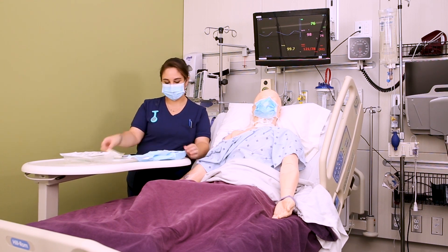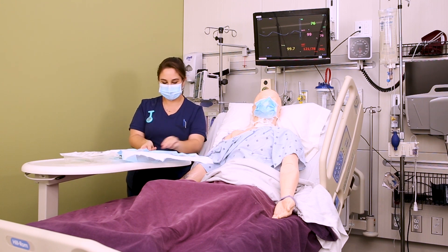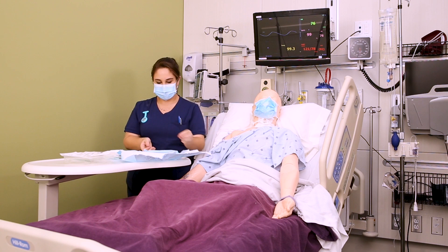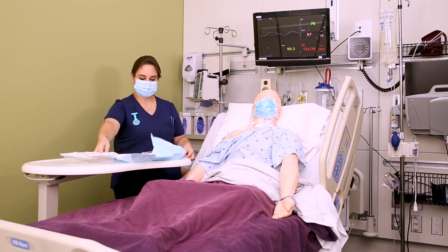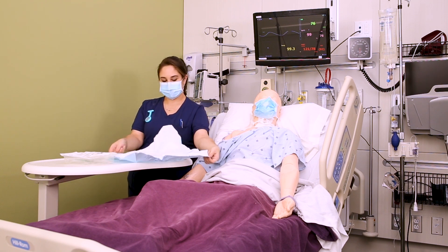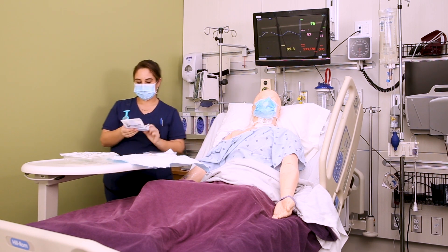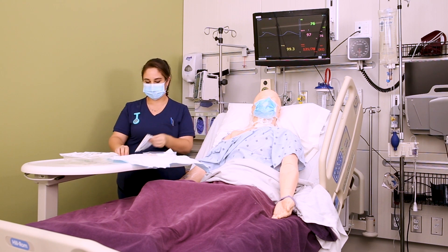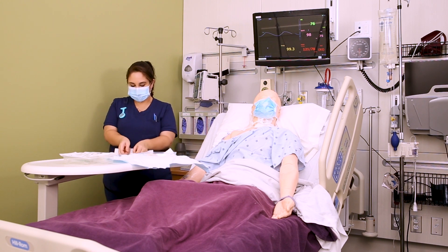Keep the table really close to you so you don't have to turn your back on it. In complicated situations, place the table closer to the head of the bed to keep it in front of you. Only touch the outside one inch of the kit. Then grab the sterile glove pack off the top — push down and pinch it to get it out.